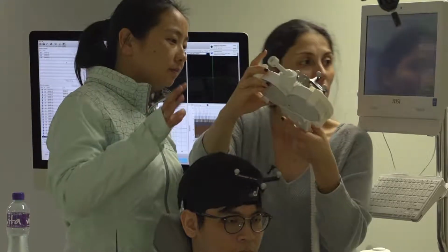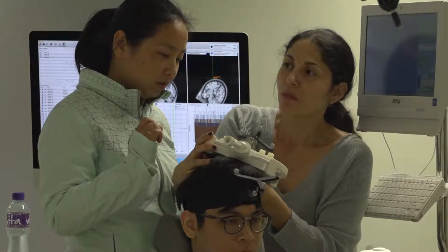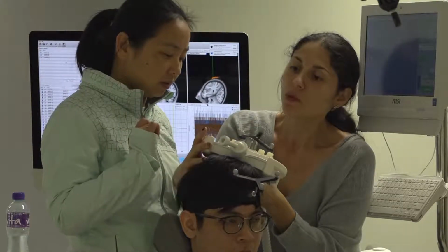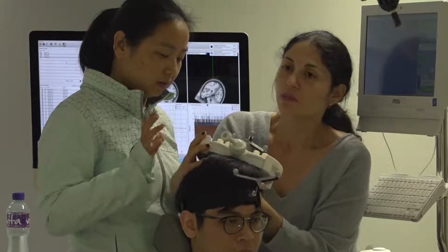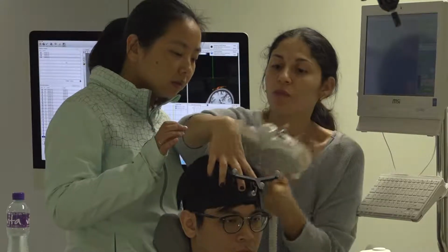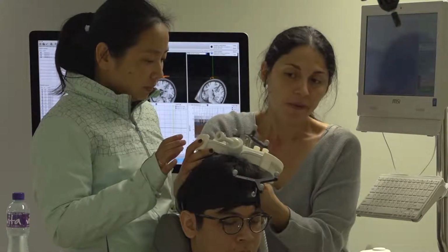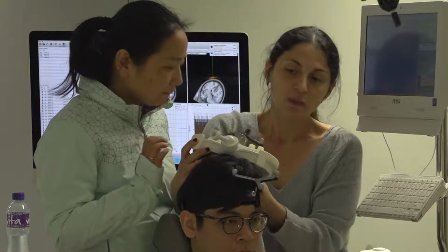You want to hold the coil in this way and put it here so that it doesn't move. Not only like this, because the coil will move. You want to keep it steady on the head, and you start searching from there. The position you want will probably be somewhere here, and there you put the center of the coil. Let's check. So you start playing from there.